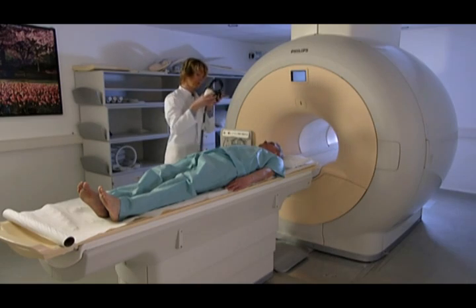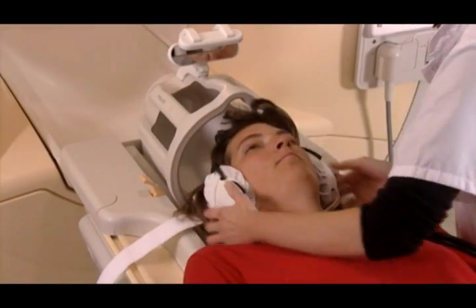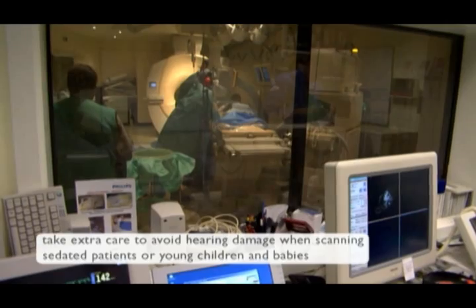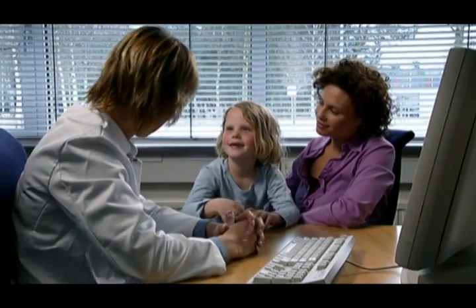Contraindications. Since all patients can usually be provided with hearing protection, there are no patients for whom an MR examination is contraindicated in view of the acoustic noise production. Extra care must be given to sedated patients because they cannot indicate that the hearing protection is not applied correctly. Similarly, extra care is needed for young children and babies. There is still an ongoing debate about scanning pregnant patients and potential hearing damage for the fetus. So far, there have been no reports of negative effects of the acoustic noise of MR systems on the fetus.